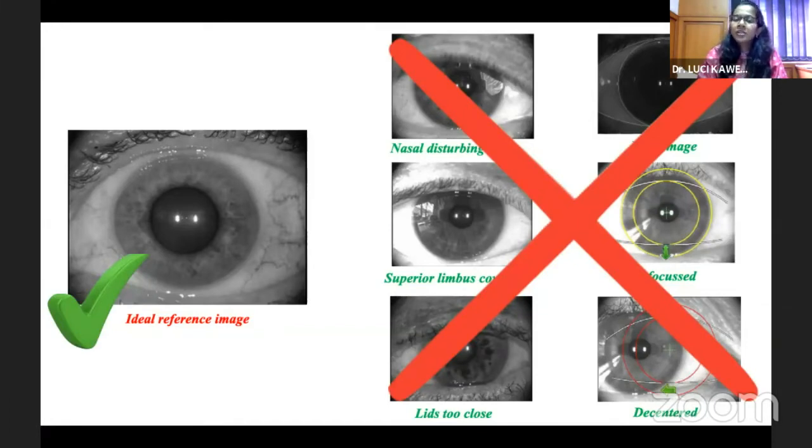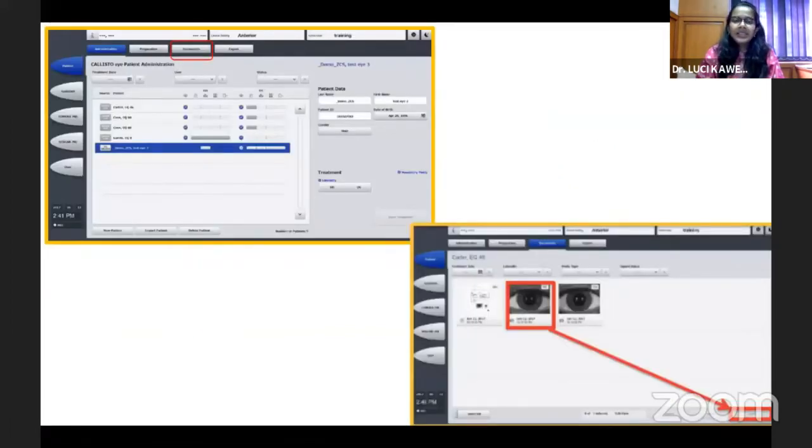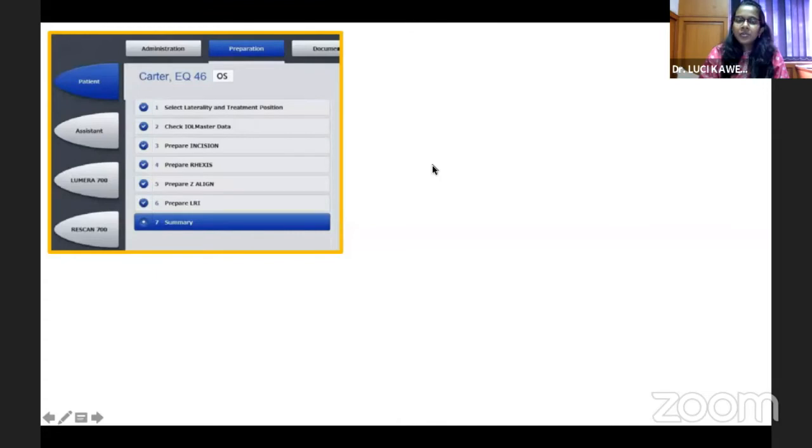If you have good exposure, your keratometry will also be perfect and there won't be any quality warning. Once this image is taken, it goes to the Zeiss Forum EQ Workplace and through the LAN network can be directly transferred to the microscope. On the microscope, you select the patient and click on the document to see the reference image. If the reference image was not good during preoperative planning, you can call the patient again or get a good reference image on the day of surgery prior to taking the patient to the OT.